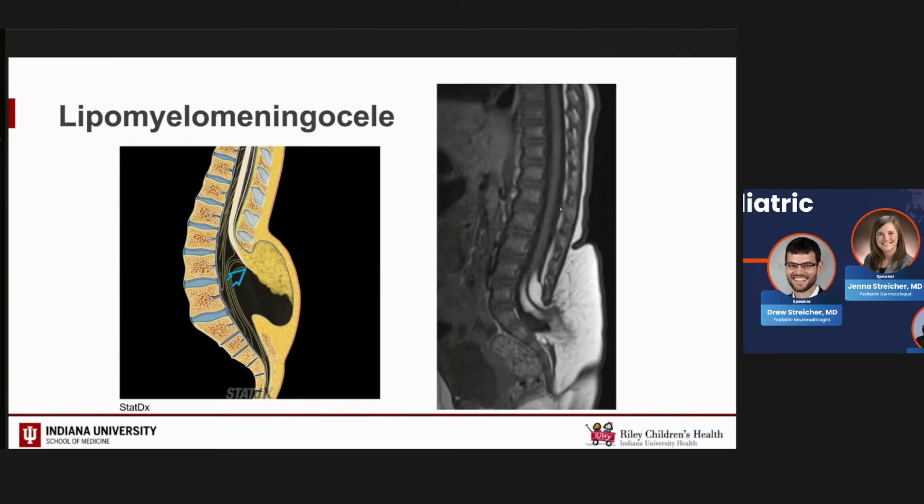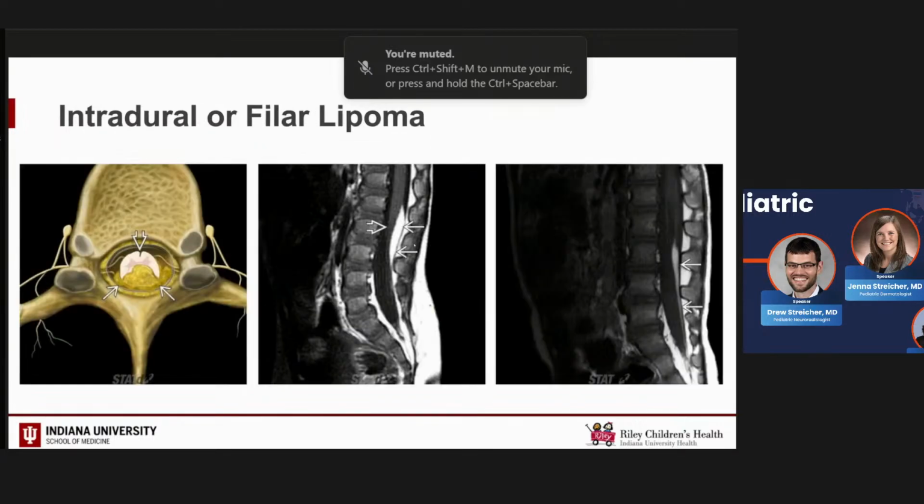So here's our example on a sagittal T1 weighted sequence. Again, we have the low-lying cord coming down. We have pretty extensive intraspinal fat. And you'd say, well, isn't this actually just a lipomyelocele? That interface is all within the canal. But if you keep following the neural placode down, that linear, kind of curvilinear T1 low signal that is continuing on is all actually neural placode, and that goes all the way beyond the confines of that dysraphic defect. So this is a lipomyelomeningocele.